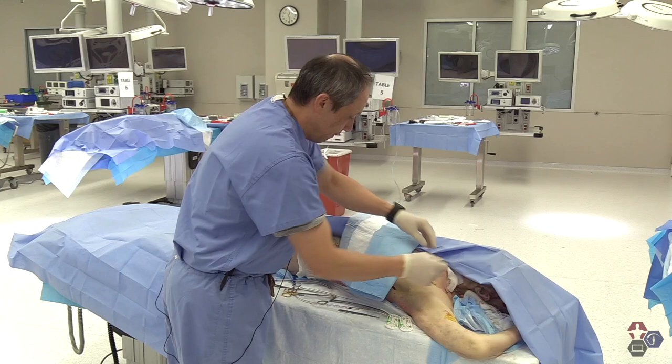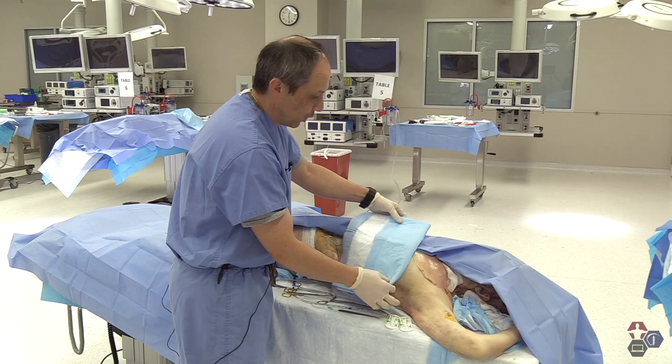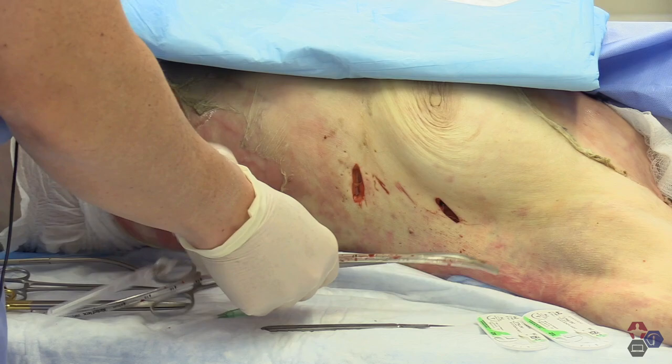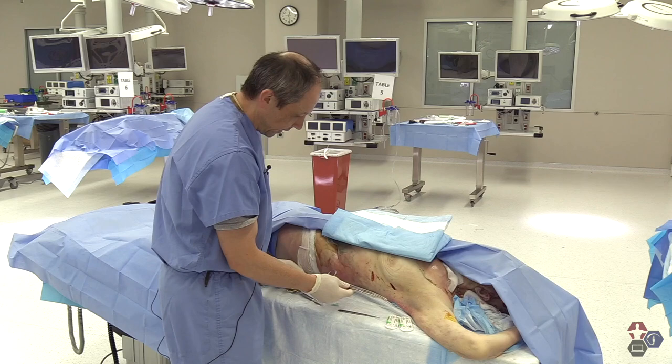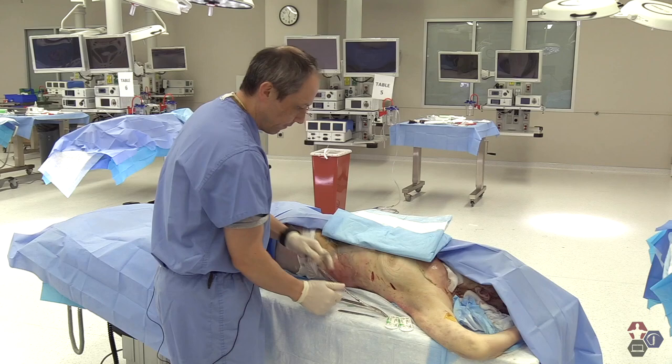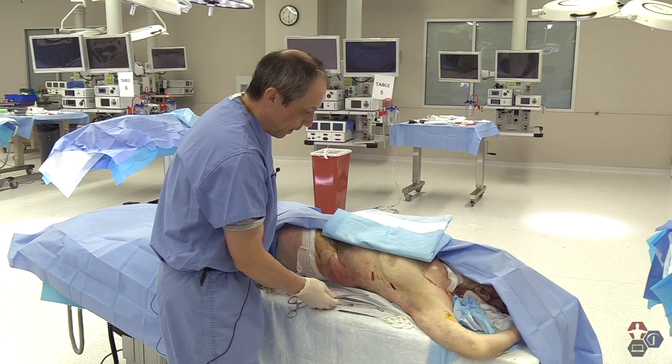So let's go on to the second method of evacuating air or fluid from the chest. This is the traditional chest tube method. As you can see in this cadaver, we've already done a few chest tube insertions, so we'll just slowly simulate as we insert. The supplies you need for the insertion are a chest tube, a Kelly clamp, a second clamp at the end of the chest tube itself, a scissors, another clamp, some suture material, and of course a scalpel.